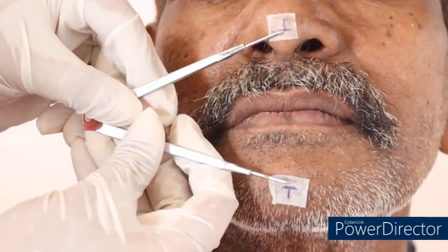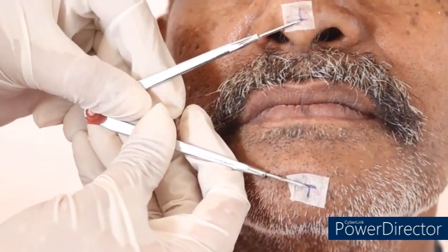It should be placed on the tip of the nose and tip of the chin, and the divider is used to measure the vertical. The patient is asked to bite the denture, and the distance between this point and this point has to be measured. So I am using this divider to measure this distance, from this point to this point. It is approximately 60 mm.